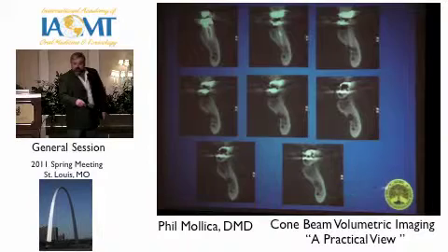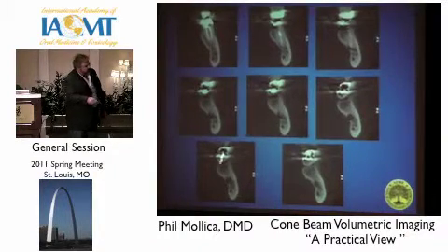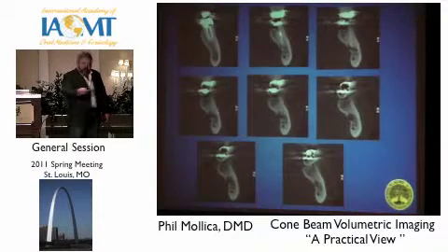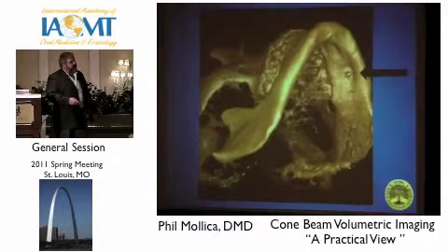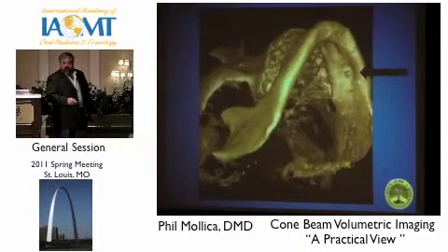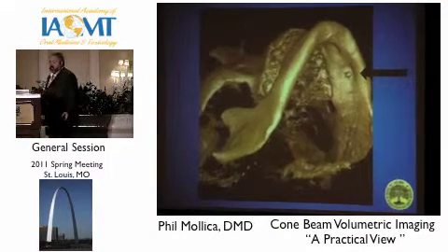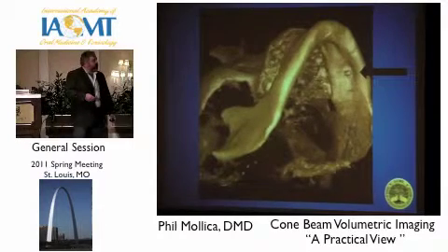Now, these are like wormholes. We talk about this all the time with ozone therapies. When you find these wormholes working their way through bones, how do you follow that? Well, at least now we can follow it and measure that. And the interesting thing is we take a three-dimensional picture, look at the hole in the bone right here. I mean, how would you see that? You can't. These are great things that you can do with a 3D volume cone beam.